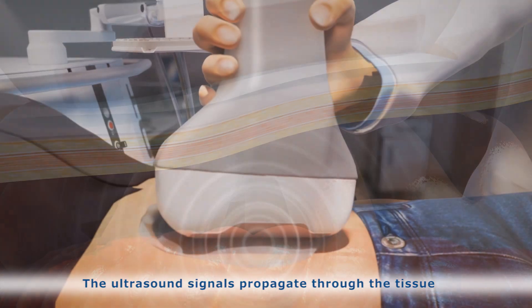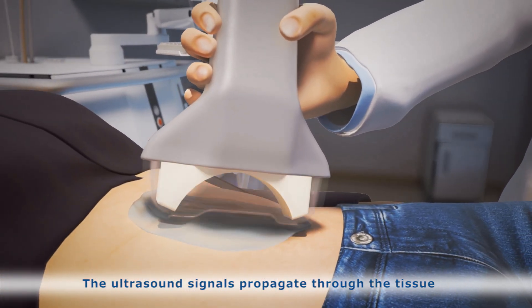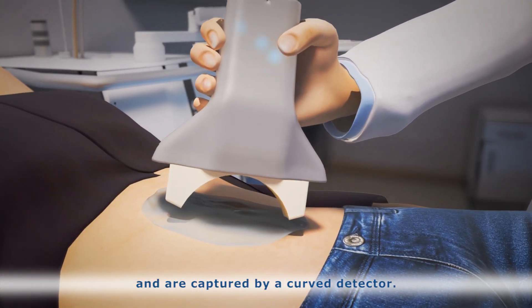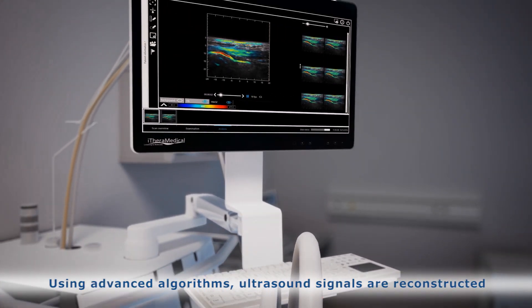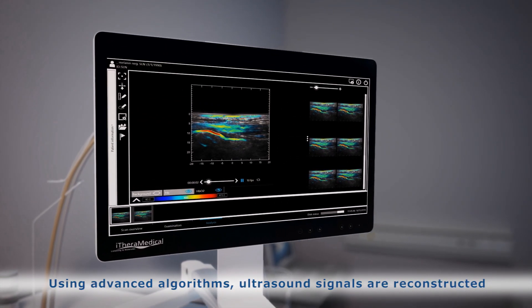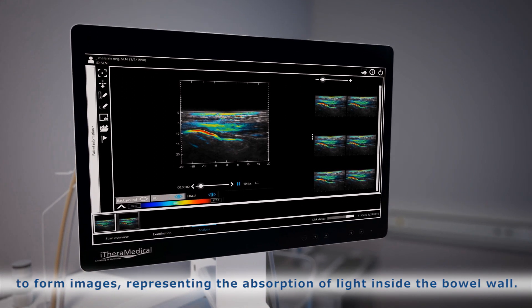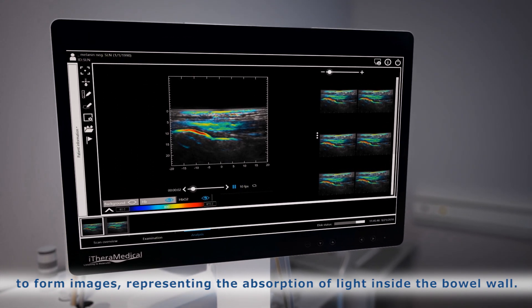The ultrasound signals propagate through the tissue and are captured by a curved detector. Using advanced algorithms, ultrasound signals are reconstructed to form images representing the absorption of light inside the bowel wall.